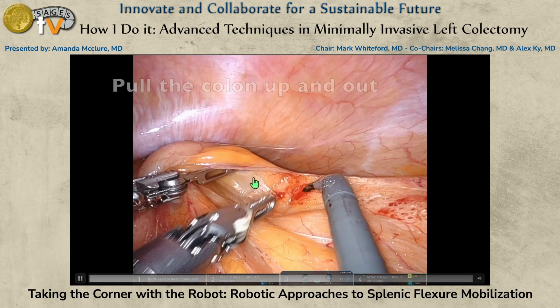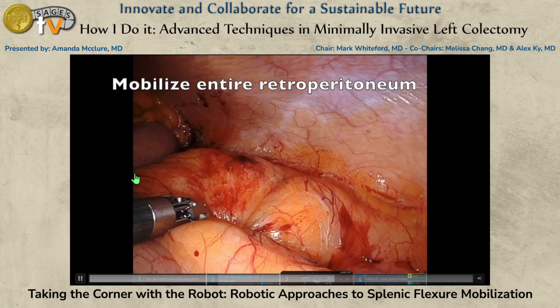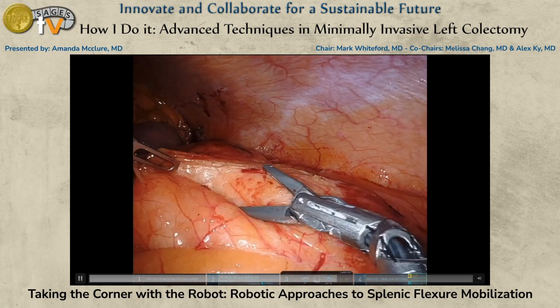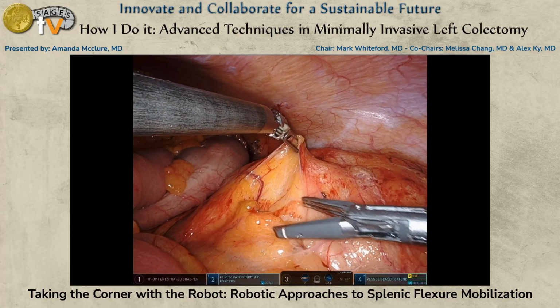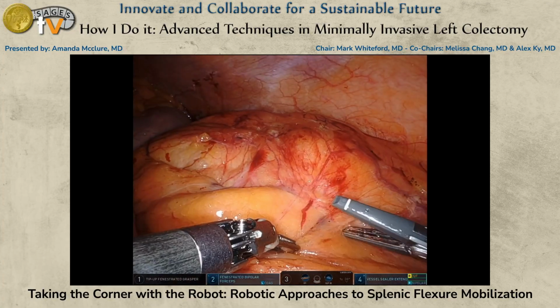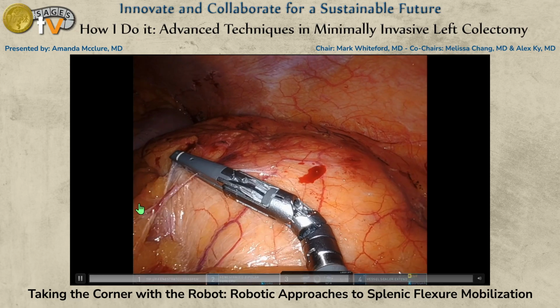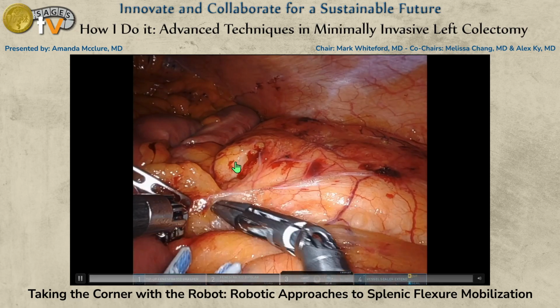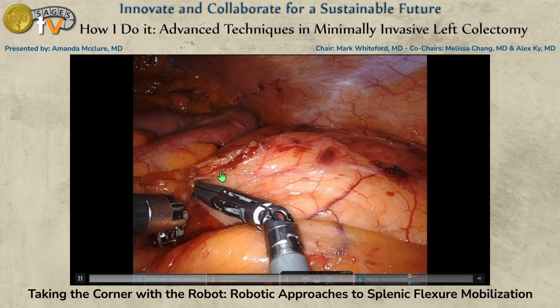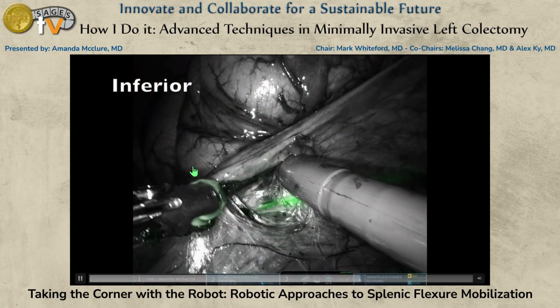If you want to pull the colon up and out, this is the biggest thing that helps. Get underneath, make that V, and then you want to make sure that you're pulling up and out versus digging in. You need to make sure you have retraction. If you don't have retraction, you're digging in a hole, and that's when you get into trouble in that retroperitoneum and into bleeding. Even if you're not mobilizing the entire flexure, you need to take this off the kidney. Medially, as far as you can go, make sure this is all off the kidney because you're going to have so much more length if you can take it all the way up there. And then if you need to take the rest of it for flexure, you have length if you need to.